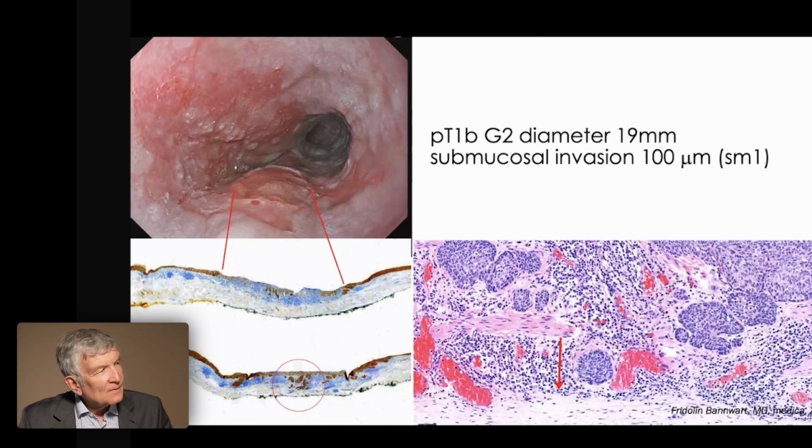Yeah. I think we experience somehow an organ-preserving revolution, and even our surgeons press us to resect the lesion first before surgery.